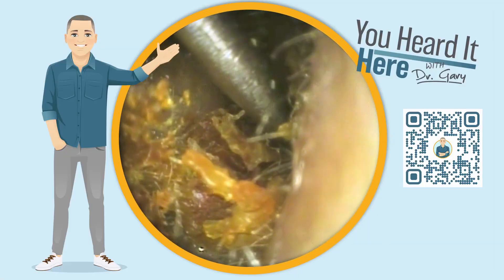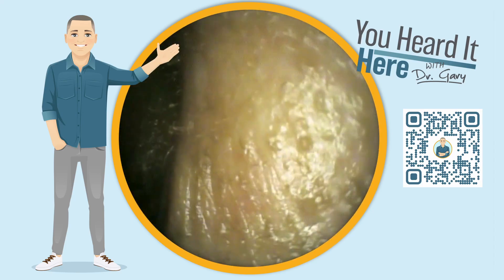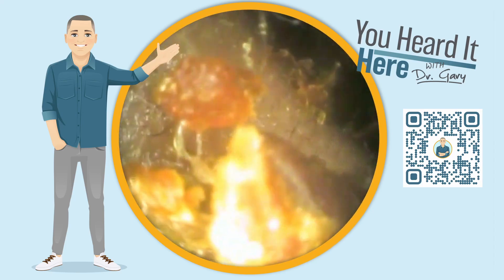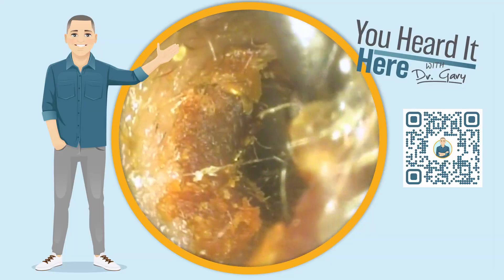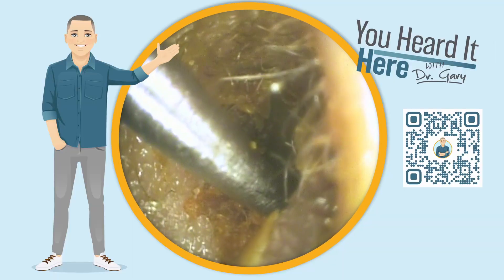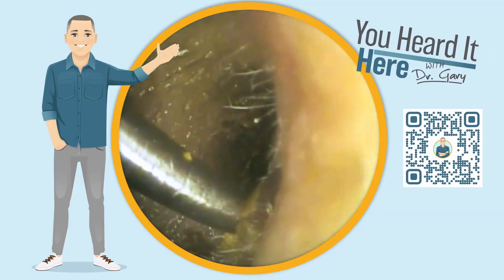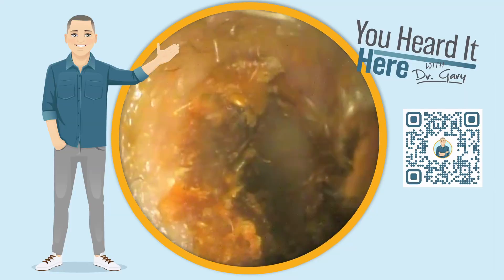As we look at this wax, we can see that it is so far down the ear canal that it was clearly pushed back. A little anatomy lesson: basically the outer one-third of the ear canal — essentially where that hair stops — that's where wax should be. Anytime we see wax way below that or deeper down the ear canal, I know that you've used something to push that wax in. It's not always a Q-tip, but that's the usual culprit.